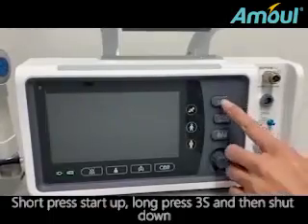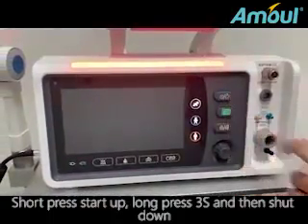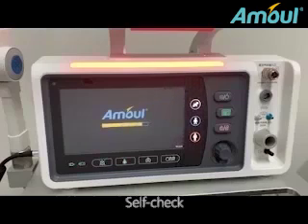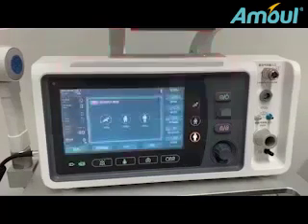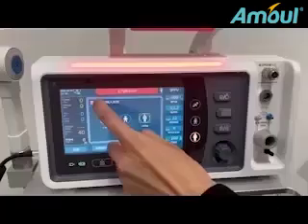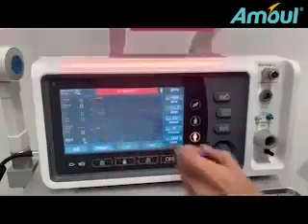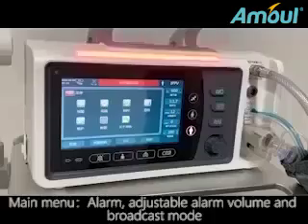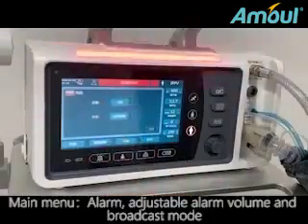Short press to start up. Long press for 3 seconds and then shut down. Self-check. Main menu. Alarm: adjustable alarm volume and broadcast mode.